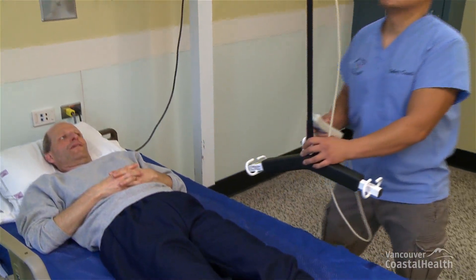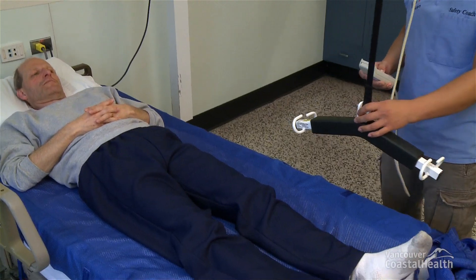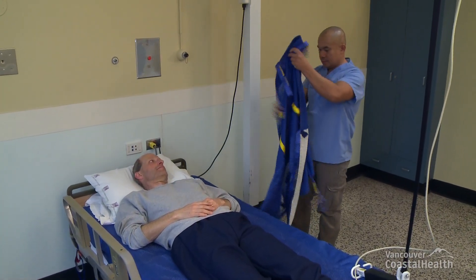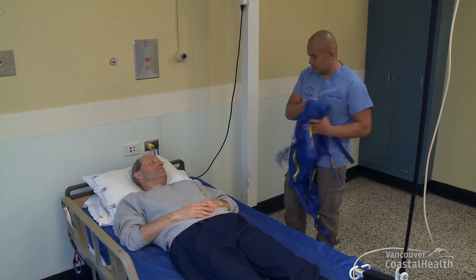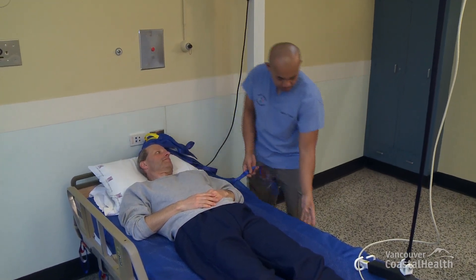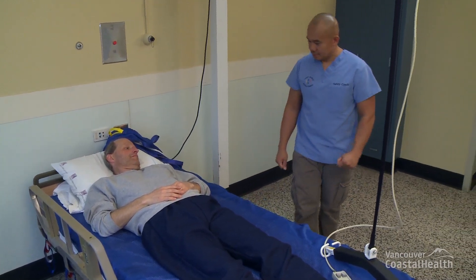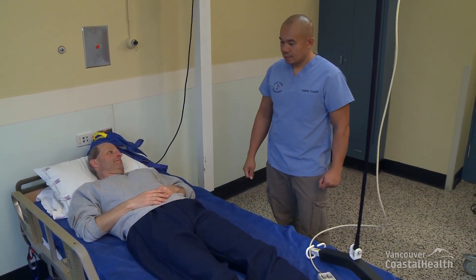Move the lift over the resident's legs. Quickly check the sling for any visible damage — for example, are the sling straps and loops frayed or torn? Is the body of the sling in good condition? Ensure the lift's carry bar is positioned lengthwise or parallel to the resident's body.